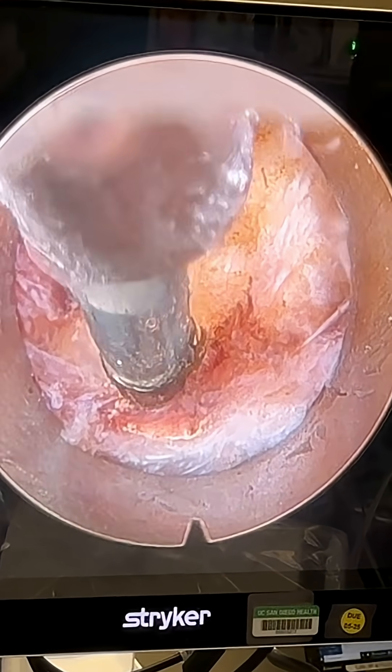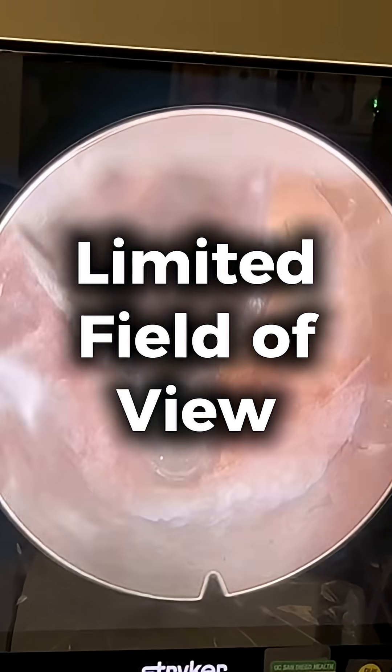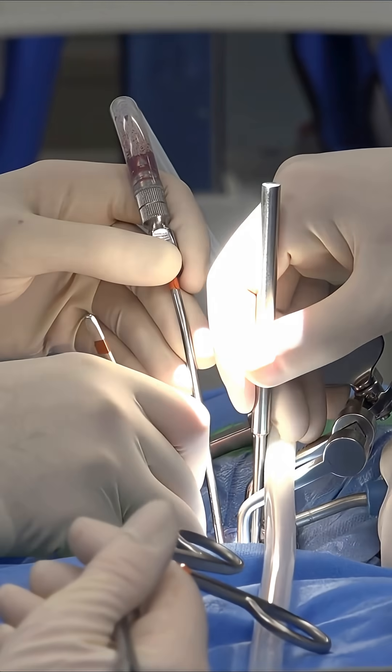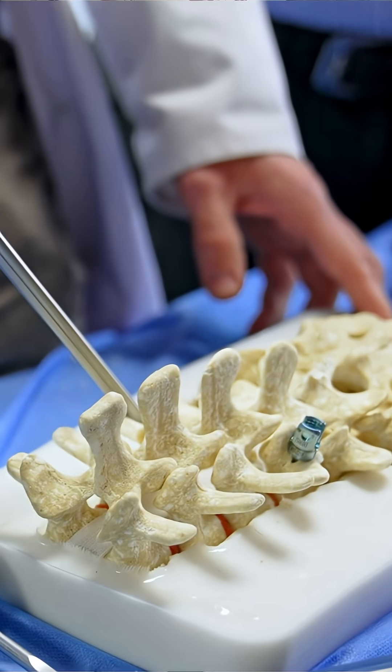And what we see the first time can be very, very confusing because it's a very limited field of view — it would be like examining an elephant with a magnifying glass. In traditional open surgery, we don't have this problem because we expose enough of the surrounding tissues that we can get a perspective on where we are.